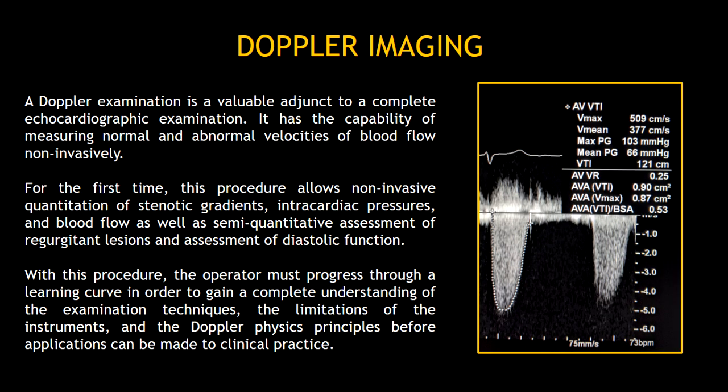A Doppler examination is a valuable adjunct to a complete echocardiographic examination because it's capable of measuring normal and abnormal velocities of blood flow non-invasively. For the first time, this procedure allows non-invasive quantification of stenotic gradients, intracardiac pressures, and blood flow, as well as semi-quantitative assessment of regurgitant lesions and assessment of diastolic function.